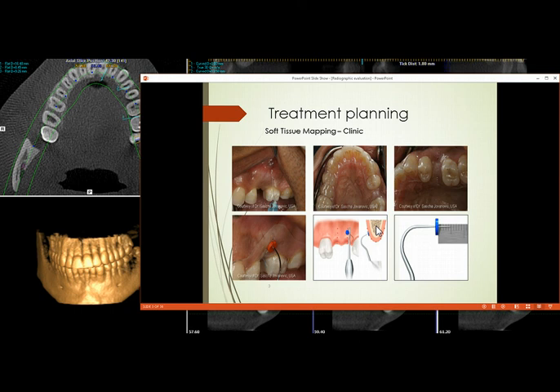We talked about different ways, for example, the periapical, CT, and PAN, and each has its own advantages and disadvantages. And one of the biggest disadvantages we talked about was distortion. And we talked about how using a fixed object helps us negate that disadvantage. We also talked about this technique right here to have an idea what the width is by using tissue mapping.